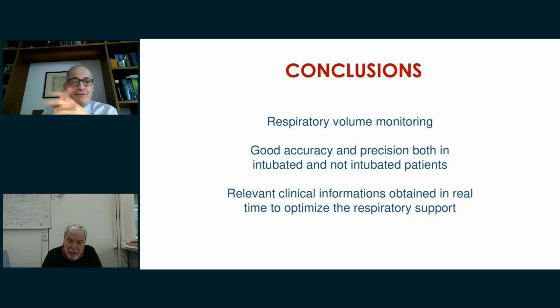And also look at the patient, for example, to see the muscles. But the problem is that it's difficult to get an exact number, because sometimes there is no relationship between the respiratory rate and inspiratory effort, especially in patients with COVID. As Professor Gattinoni told us, we sometimes have big surprises, because the patient seems quite well, with a low respiratory rate and not too big a tidal volume. Then we insert the esophageal balloon, and we find a very high inspiratory effort.